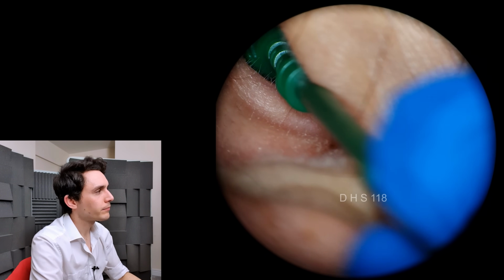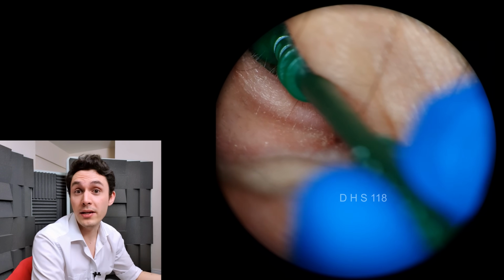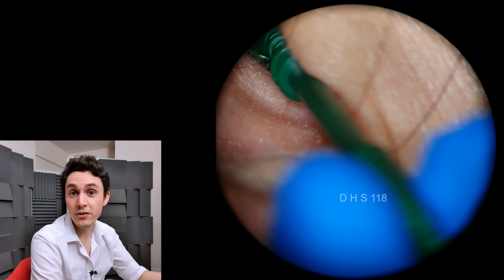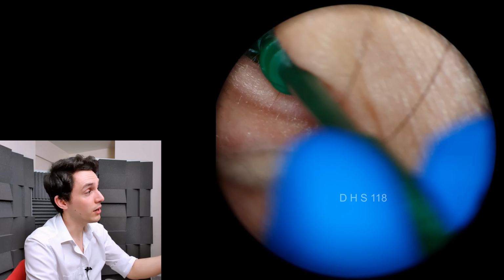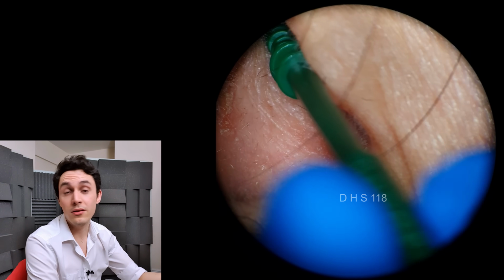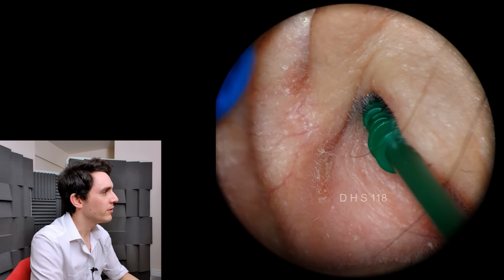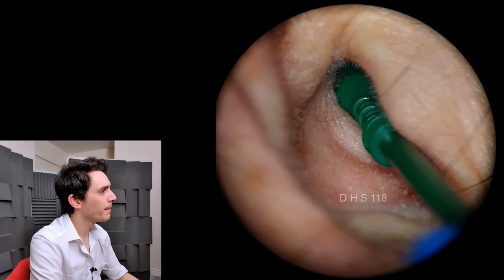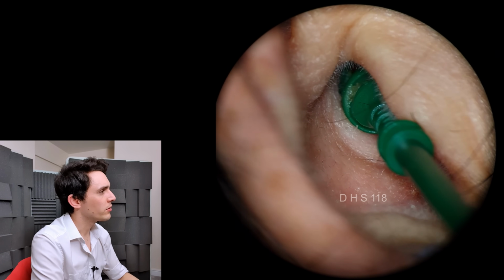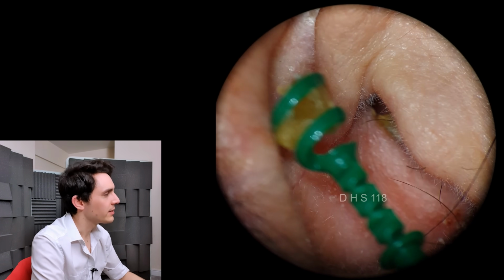But again, what I'm doing here is saving myself a bit of time, so I don't have to deal with this outer crust. I can just remove it with the large device, and then I can deal with the deeper stuff with the suction. So I'm at the appropriate depth here. I'm just going to give it a little bit of a pull, and again, we're just going to retrieve that outer bit. And there we have it.